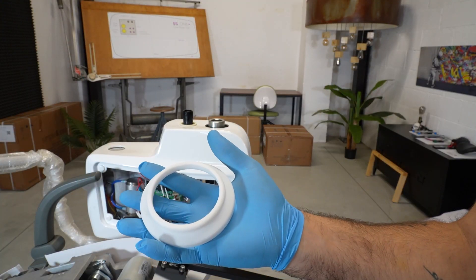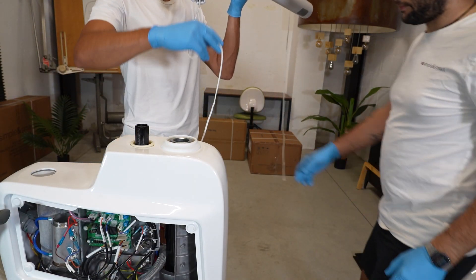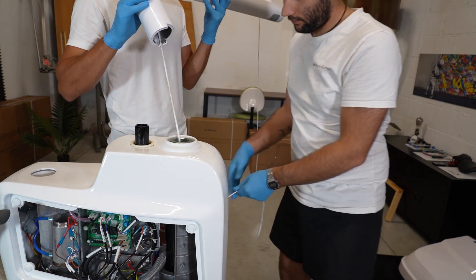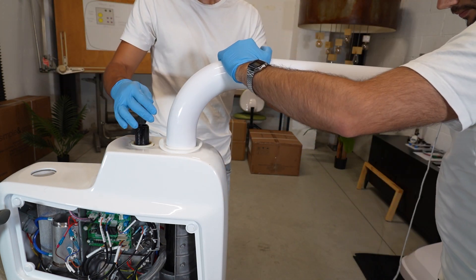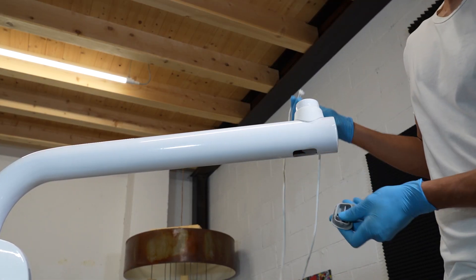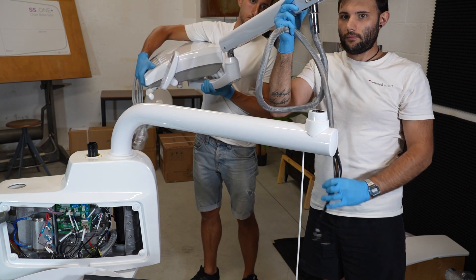Take the silicone for the doctor tray arm and put it on the water unit. Mount the first arm. The rope will be used to pull cables and tubes up to the water unit. Next you will mount the doctor tray.